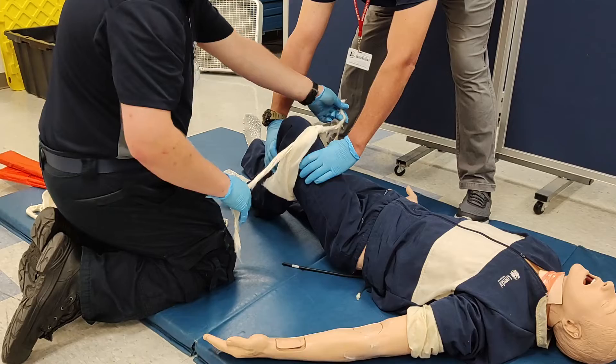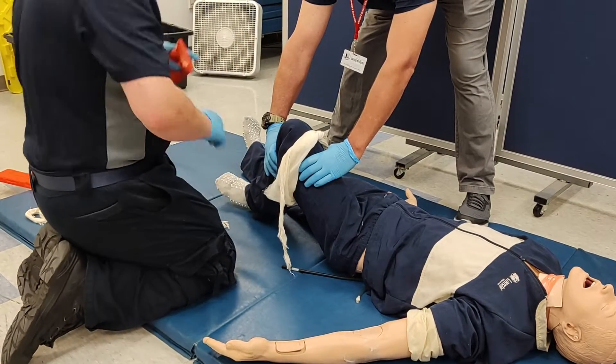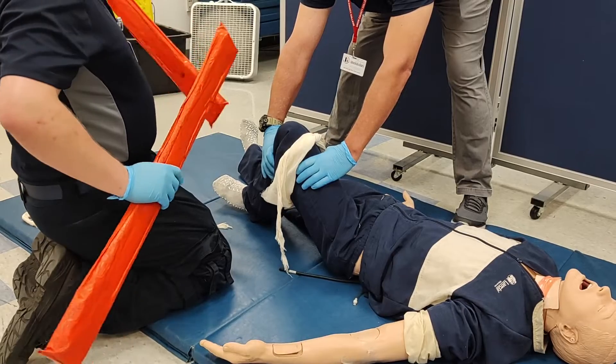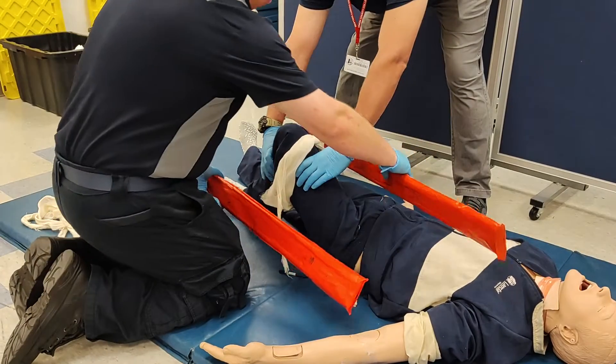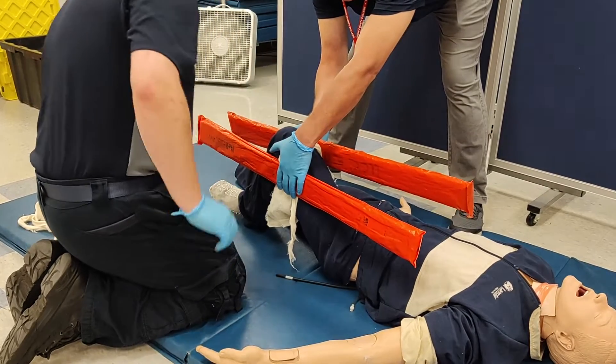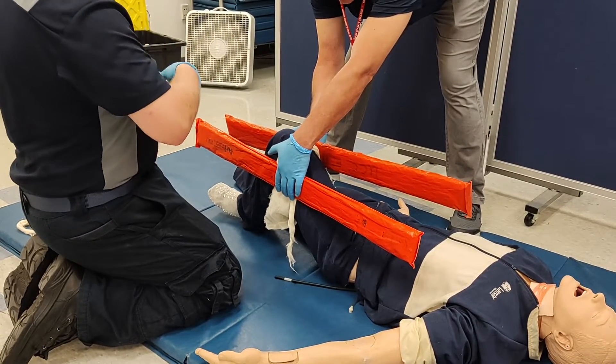EMT number two begins the application of the splint, starting with a single cravat tied just underneath the knee — not too tight, as that is the injured part. Two medium-sized splints are then arranged around the limb with the padded side towards the patient.